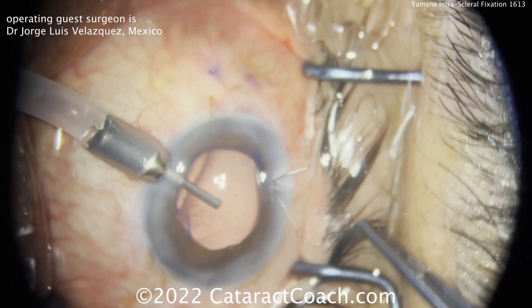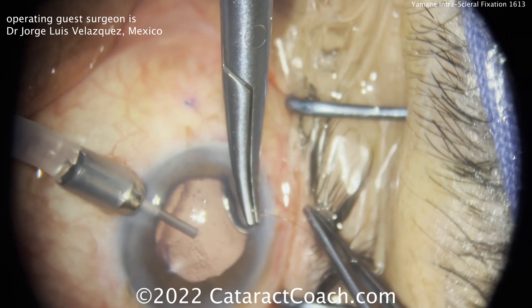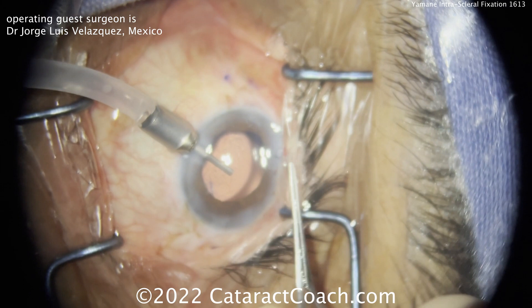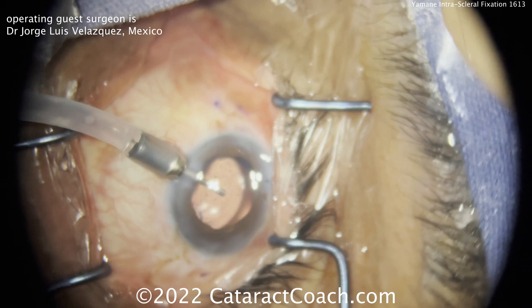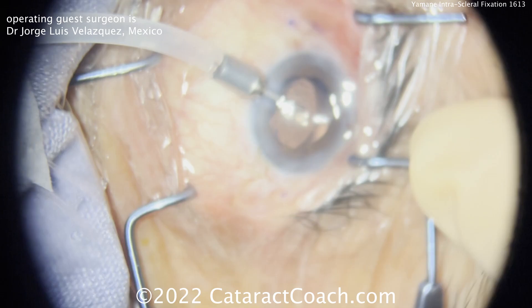The surgeon is now closing up that main incision, probably the prior phaco incision — the one the IOL was inserted through. Looking at the optic positioning, it's pretty good. Remember, in Yamane cases you can often have a slightly different effective lens position; sometimes the lens sits a little deeper than expected, and you can also have some lens tilt.